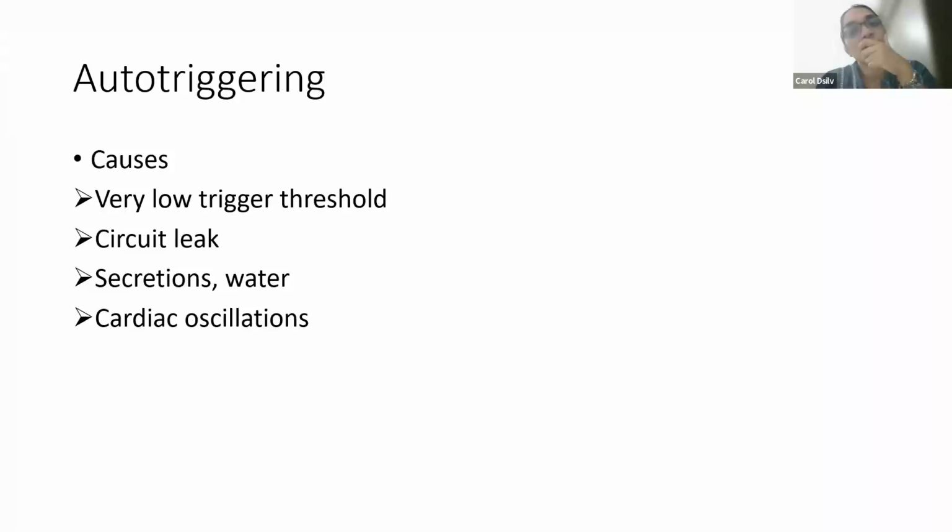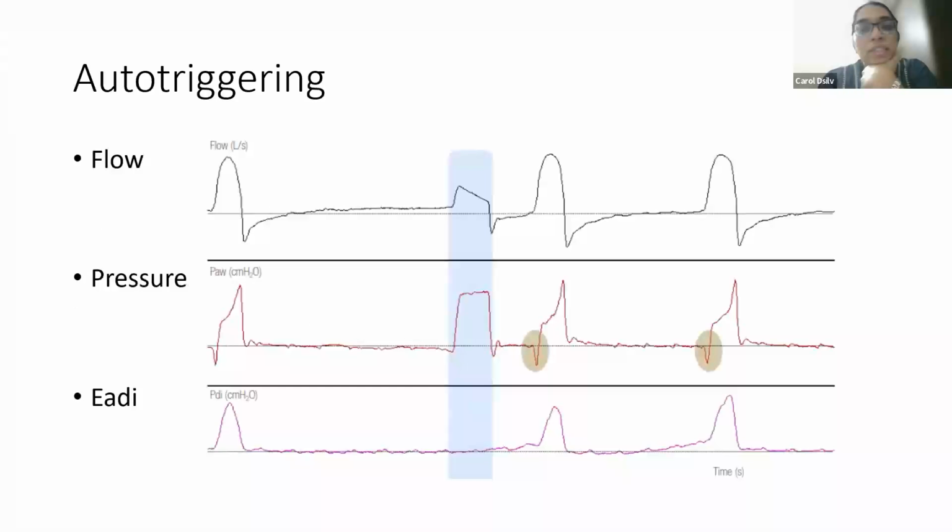This is not a typical diagram. Normally you will see multiple breaths delivered together when there is auto-triggering. I don't think this may or may not be asked in your IDCCM exams, but this is good to identify at the bedside. Okay, I think I shall end here.